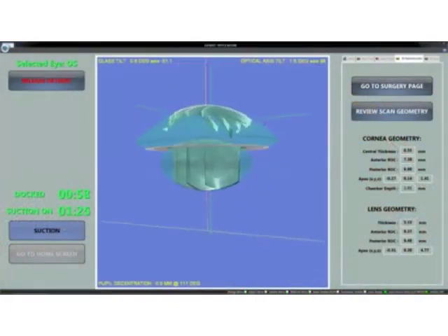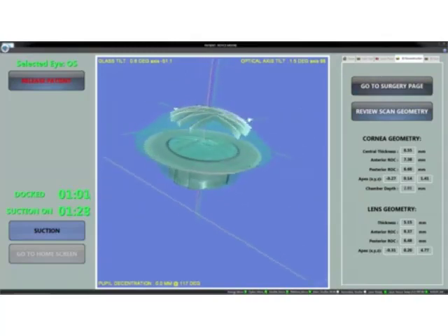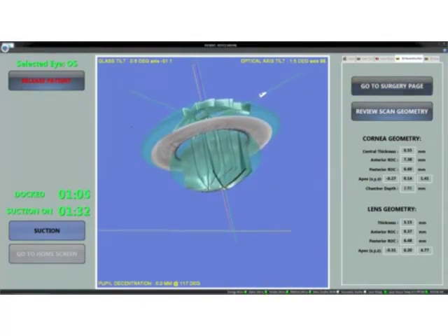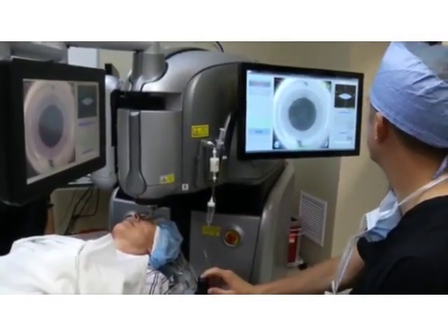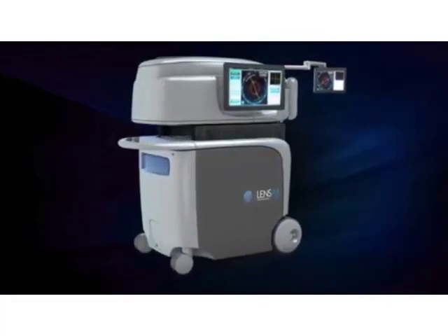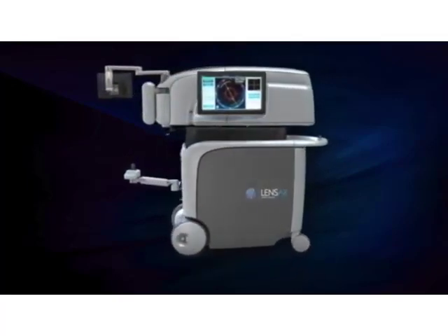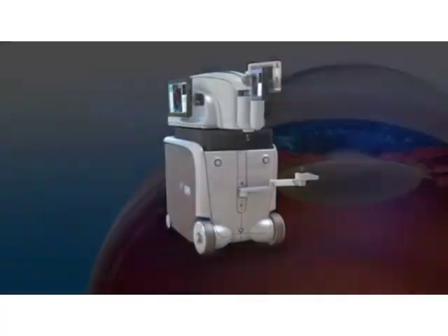The Lenzar laser system's advanced augmented reality imaging system provides your surgeon with a detailed 3D view of your eye. This allows for more detailed information and treatment choices during your cataract removal procedure. Additionally, this 3D image allows your surgeon to tailor the treatment to you, which may improve your visual outcome. By using the precision and accuracy of a laser during many of the critical steps in cataract surgery, Lenzar offers you the most advanced cataract procedure available today.